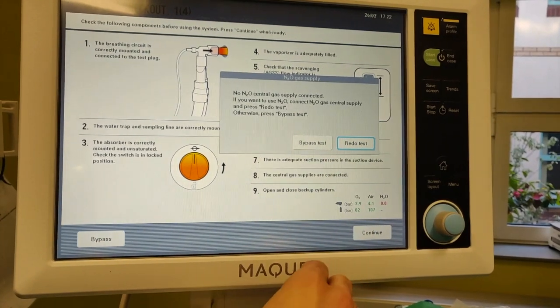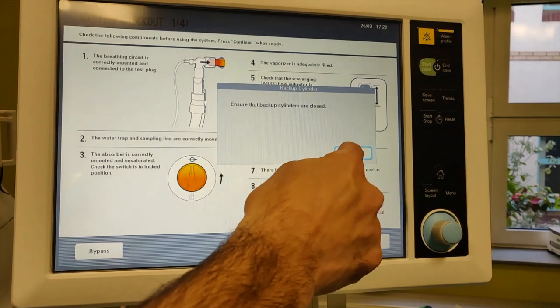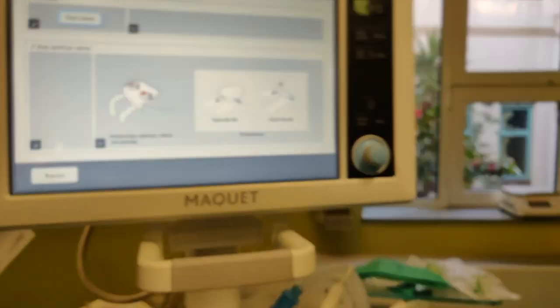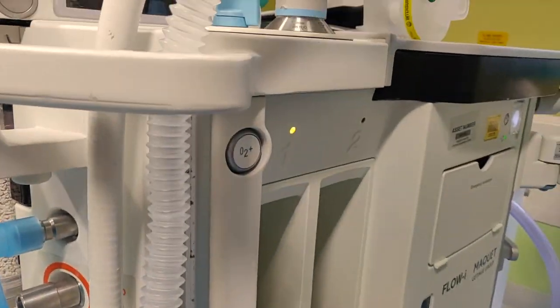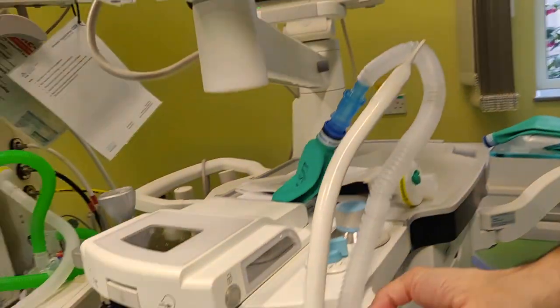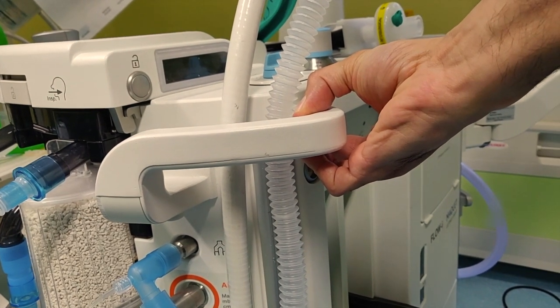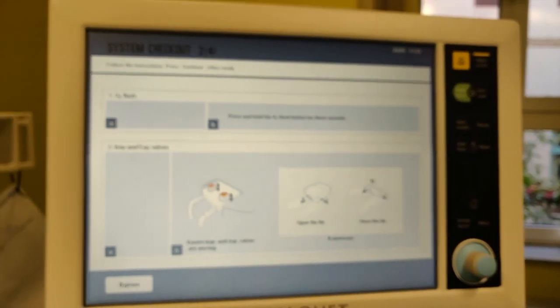There's no nitrous — we haven't got nitrous in here, so bypass that test. I've turned the cylinders off. The O2 flush — there's an O2 flush button on the side just down here. Press start to check it at the top, and it'll ask you to press and hold for three seconds, which will confirm it's passed. Excellent.